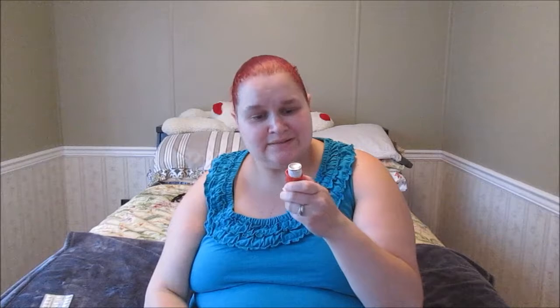This is my Ventolin. Moving on to the orange one — it is a steroid puffer called Flovent, a fluticasone steroid for oral inhalation. It's a little stronger. The Ventolin I use up to three to four times a day; the Flovent I use twice a day.